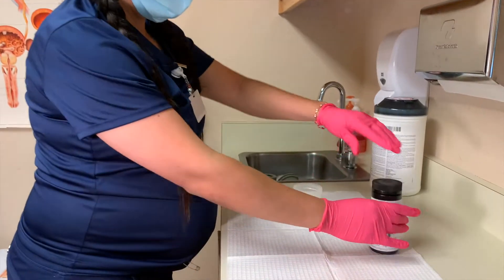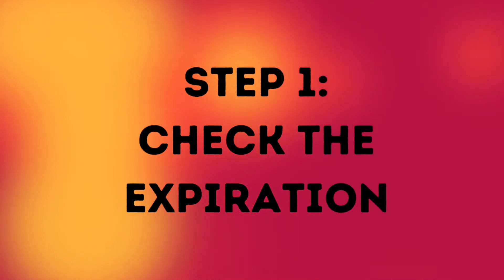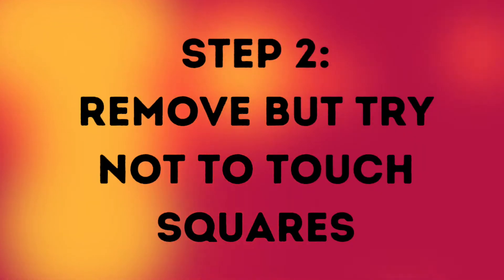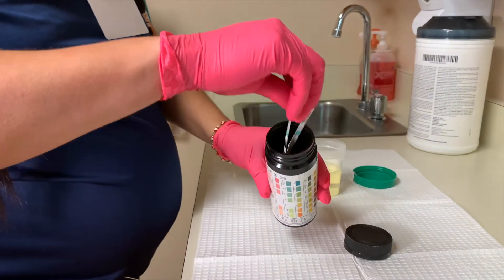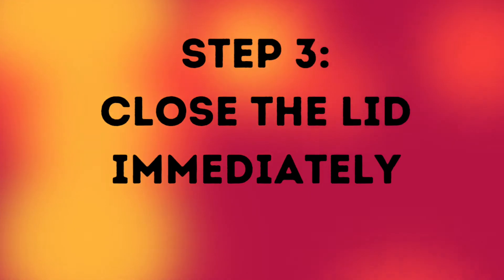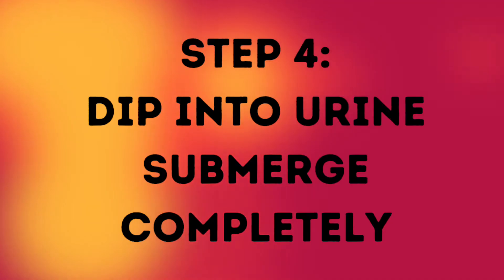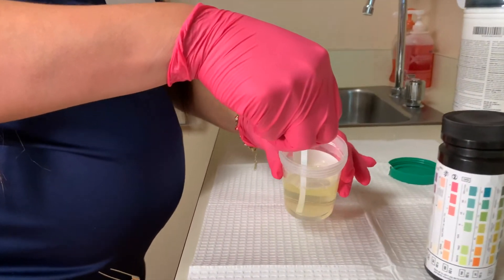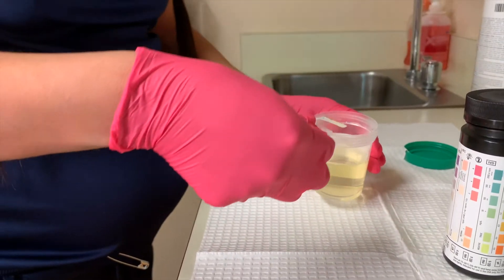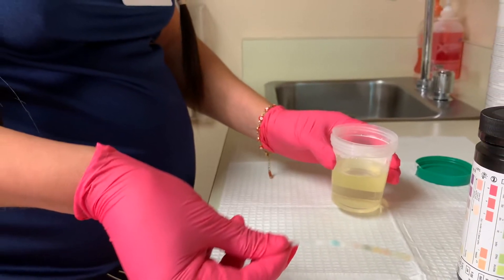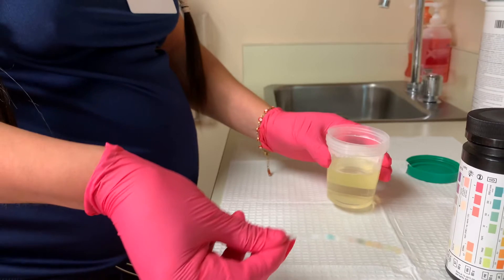After you've urinated in a cup, wear some gloves. Step one: make sure that your test kit hasn't expired. Step two: take one out of the container and try not to touch the reagent squares with your finger. Step three: close the lid immediately to prevent oxidation. Step four: dip the urine sample and make sure all the squares get submerged in the urine. Step five: remove it immediately and then tap off any extra urine. Try to hold the stick horizontally and not vertically, otherwise it might cross contaminate the reagents and bleed onto the other squares.